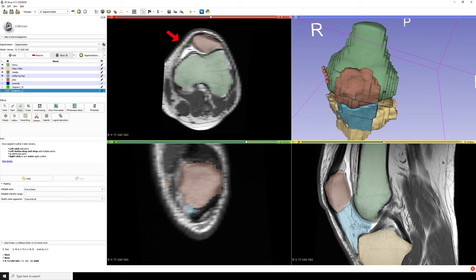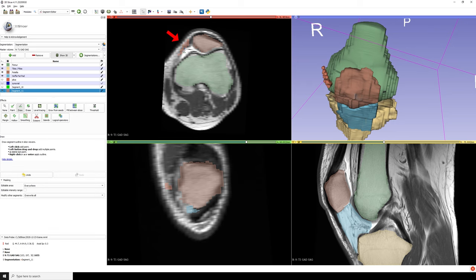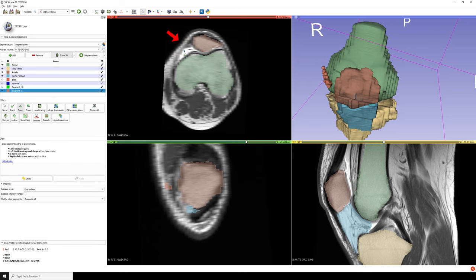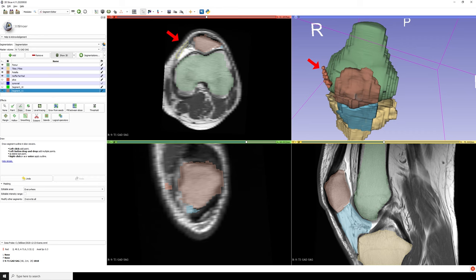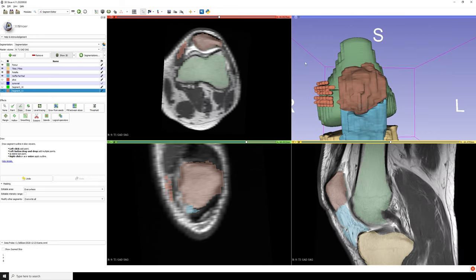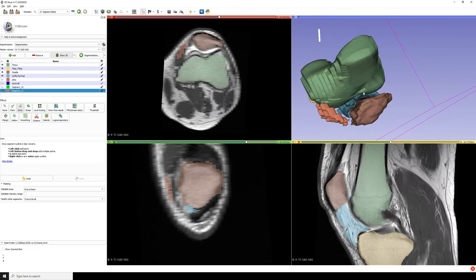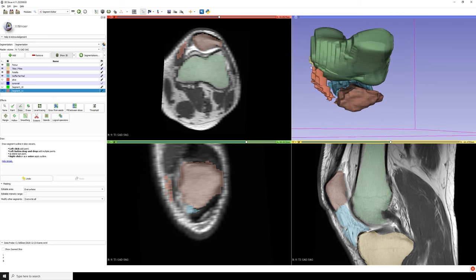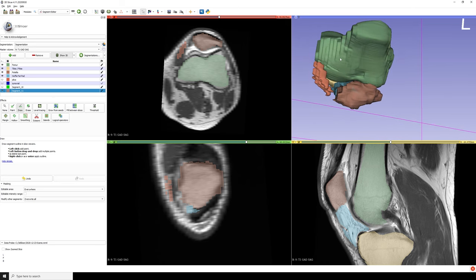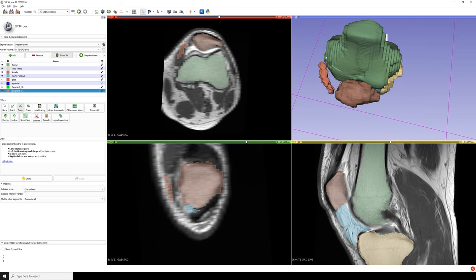So I'm scrolling through the imaging here, loosely tracing the area that the synovial lining is in. You can see this show up in real time in the 3D model here in red. And if we move over, we see pretty much what it's supposed to look like, which is this sheath on the outside of the knee.